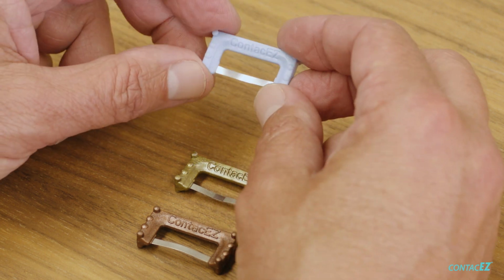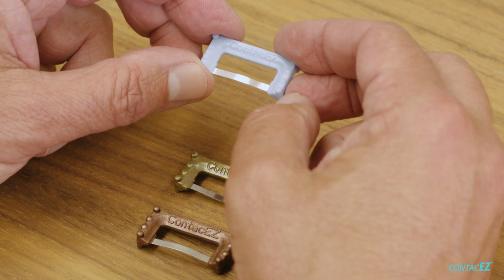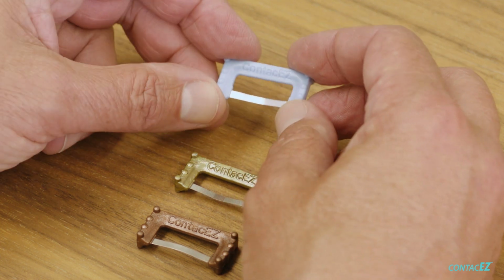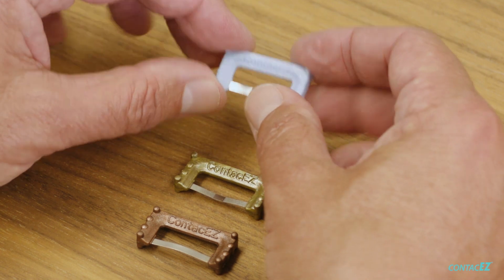So this is for a big protruding overhang that we need to cut through. It'll also work for resin cement if you have some of it protruding out of, say, the gingival box on an inlay or an onlay. You'd be able to cut it off with this one as well. So that's actually the cutter.